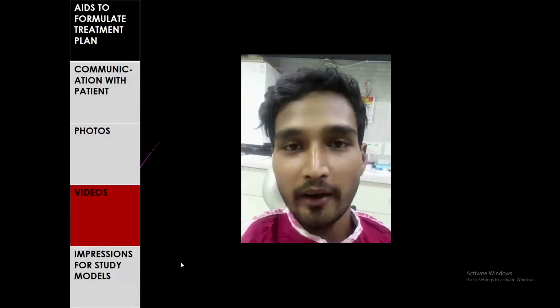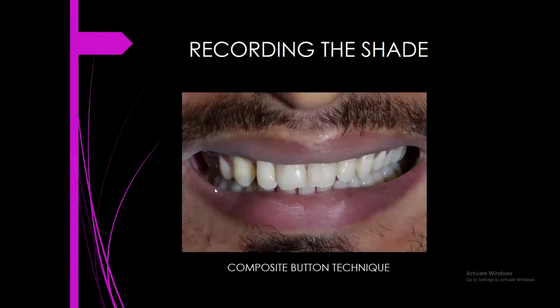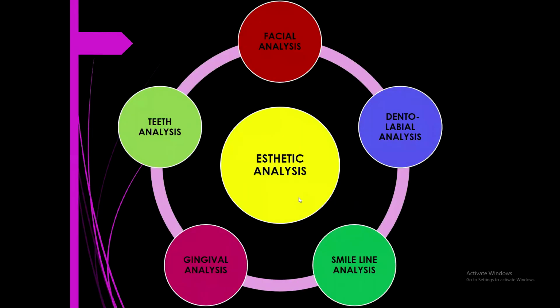Here, a video was taken of the patient, wherein when the patient speaks the words, we observe how much the incisal visibility is. Next, we made impressions and study models out of it. The shade was recorded using the composite button technique and also using the Vita shade guide.